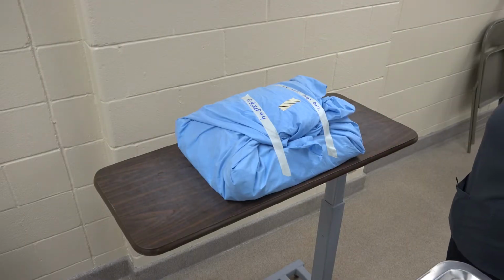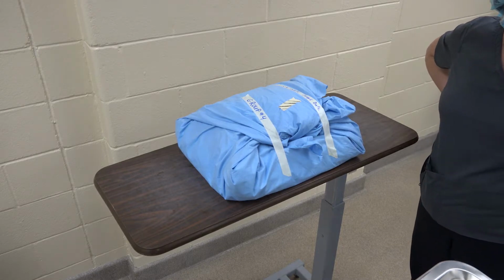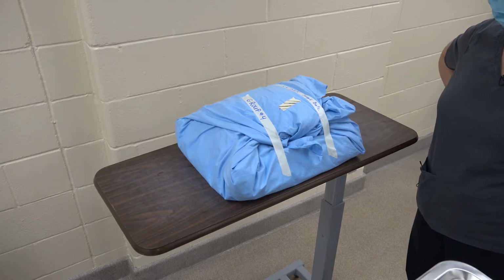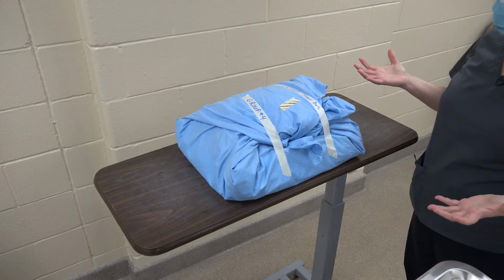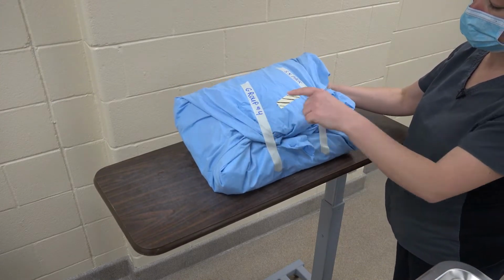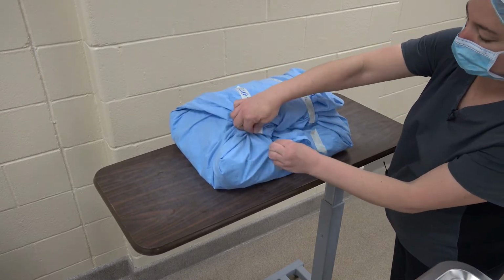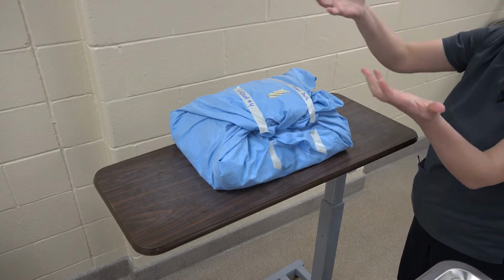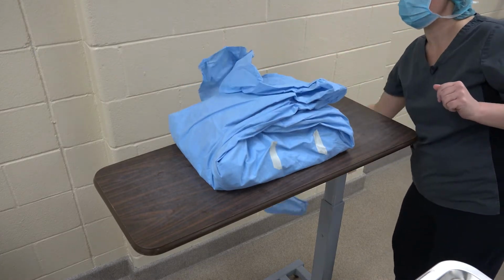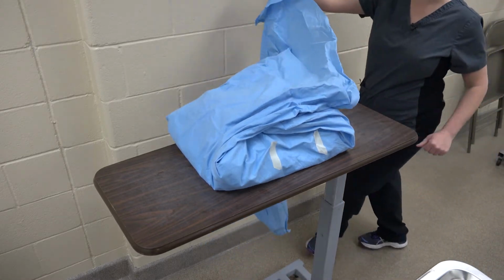All right, guys, now we're setting up our surgery suite, and while anesthesia is moving your animal onto the table and setting them up, getting them tied in, all of their equipment put back on them for monitoring, you're going to open up your surgery pack, just the outside drape. So first thing we do is we make sure this is our group number and that it has been sterilized. Break these outside pieces of tape, and then you want to touch, your hands are not sterile. So we want to touch the outside portion of this, not the inside portion, okay? So each time you grab one, you grab the outside portion. Whoops, I went the wrong way.